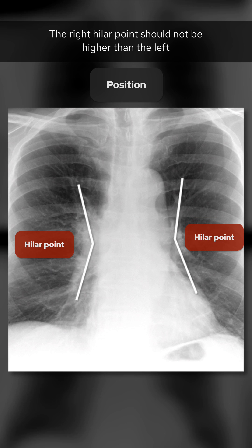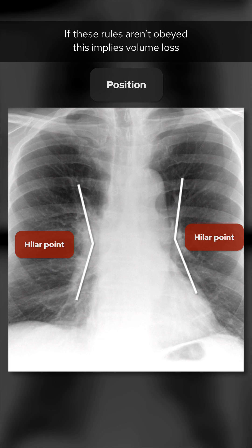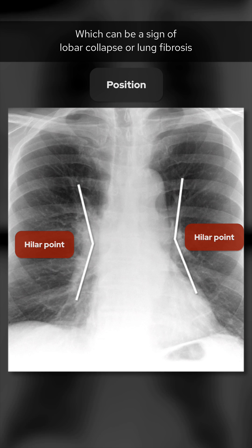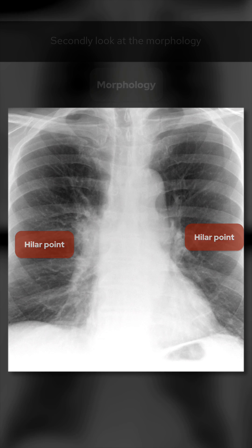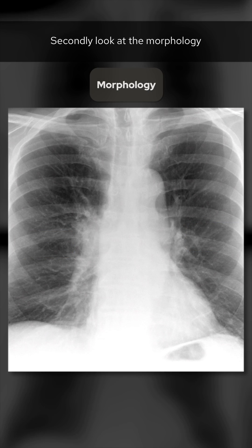The right hilar point should not be higher than the left. If these rules aren't obeyed, this implies volume loss, which can be a sign of lobar collapse or lung fibrosis. In this case we are okay.